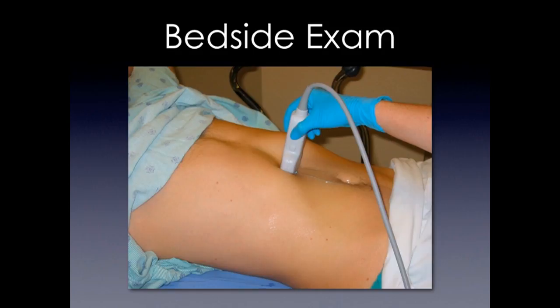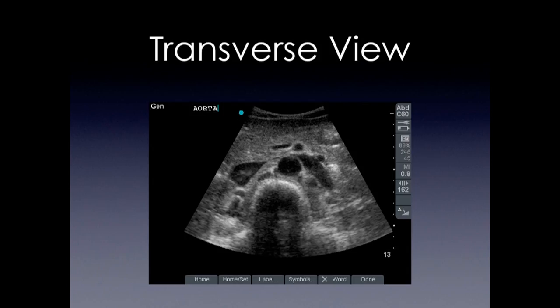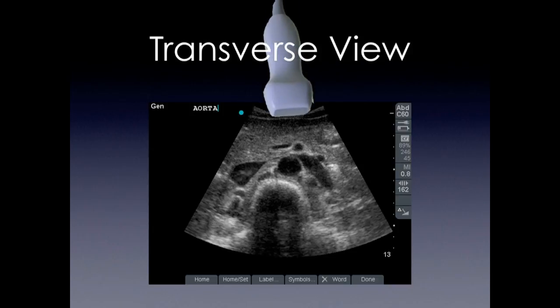We're going to start with a curvilinear probe at the sub-xiphoid level, making sure our transducer is pointed toward the patient's right. This is the view we're going to get where our transducer sits on top, and the patient's right is going to be on the left side of the screen and the patient's left on the right side — kind of the same view you get when you're looking at a CT scan from the patient's feet upward.